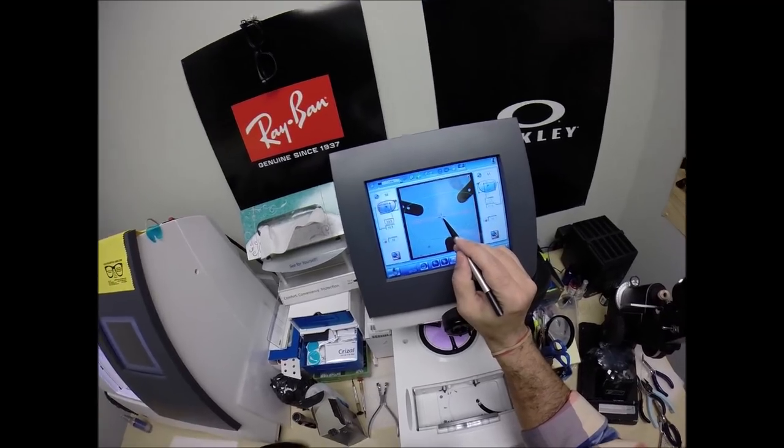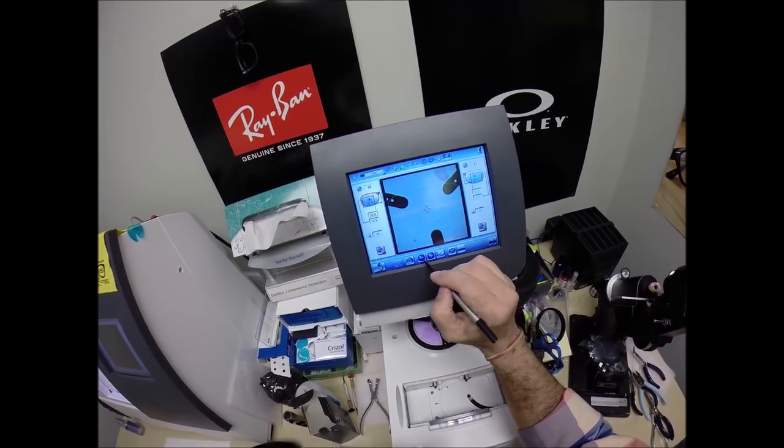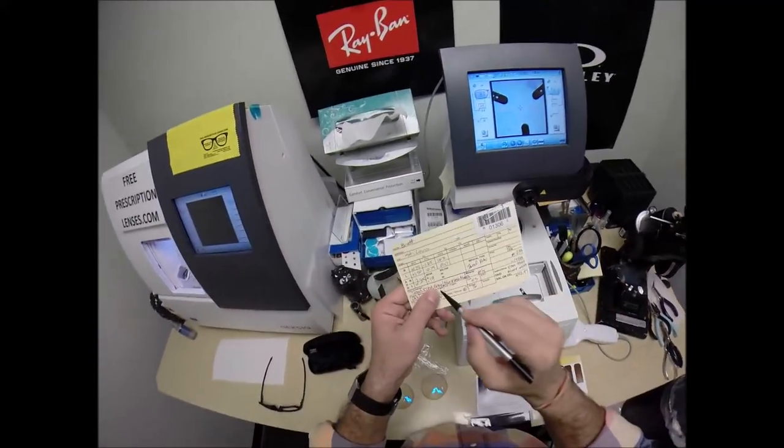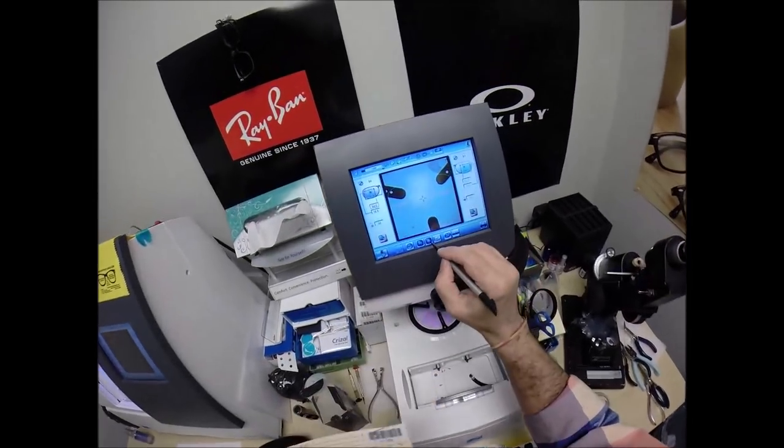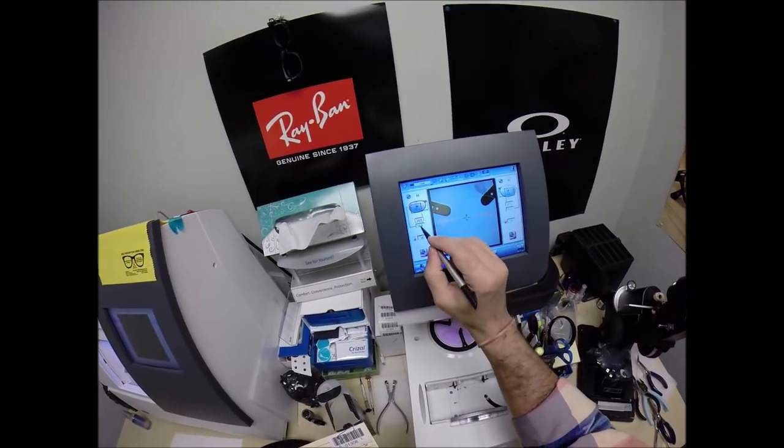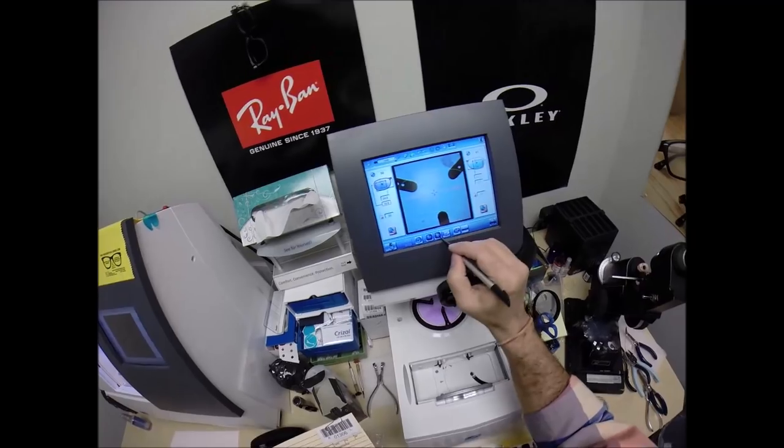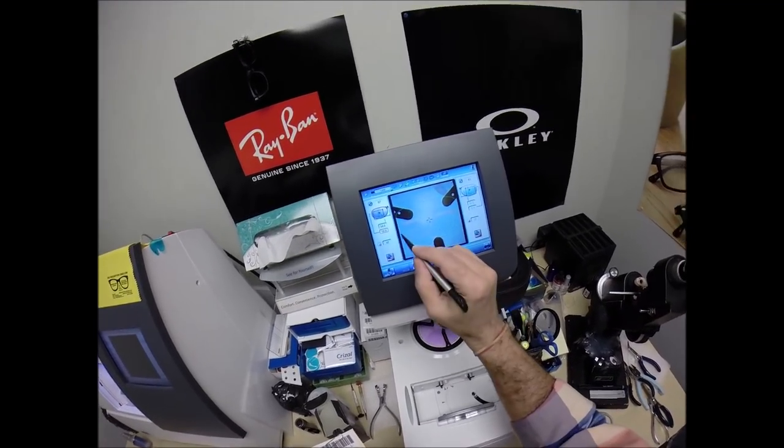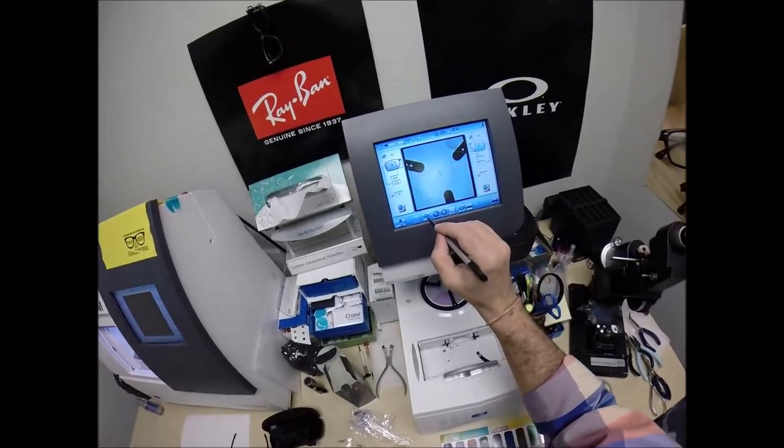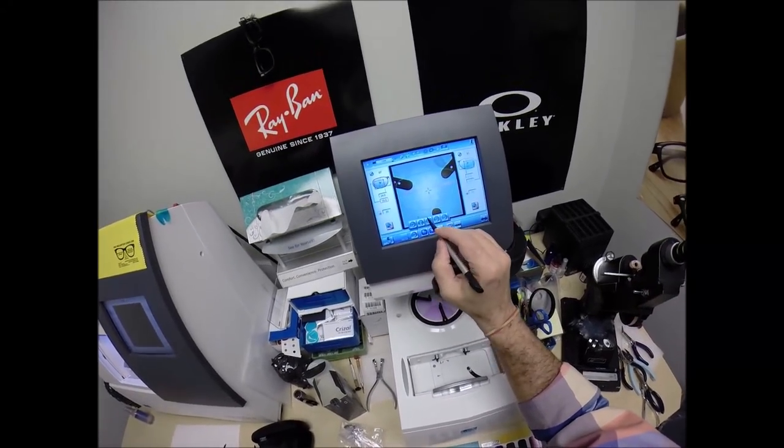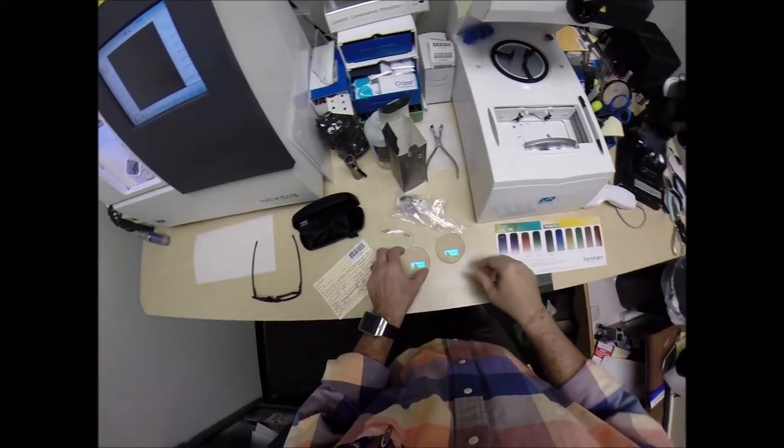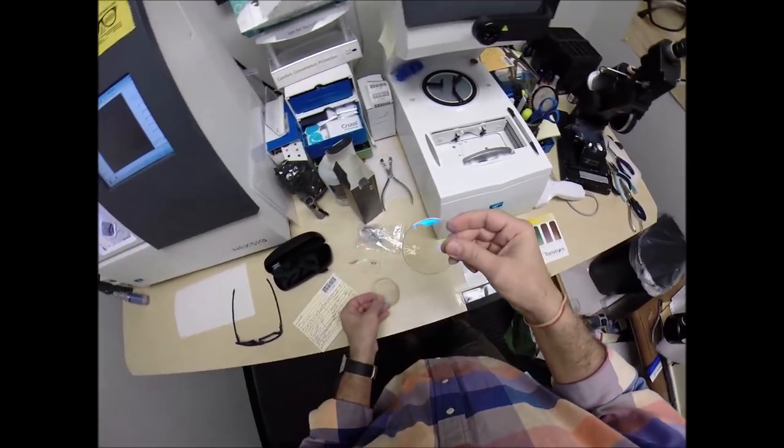Dead center is 34.5, the geometric center of your frame. Your eye is going to be just above that at 19 millimeters. Now I'm going to change the layout screen. This is for single vision. I'm going to do a progressive lens.